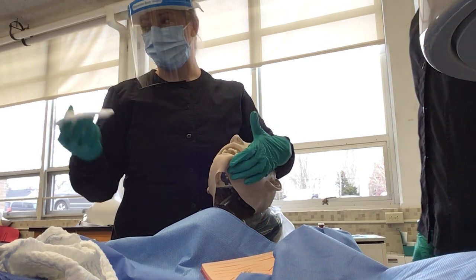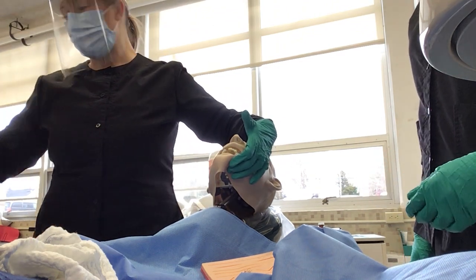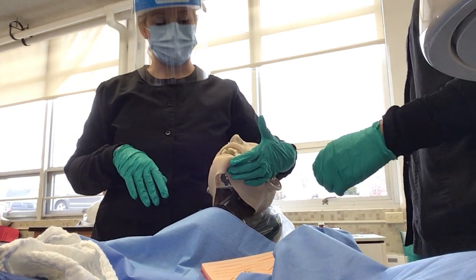If he was dirty on the outside of his face, we would wet one of our 4x4s, and we'd clean him up, okay? We don't want him walking around with a bloody mess, okay?